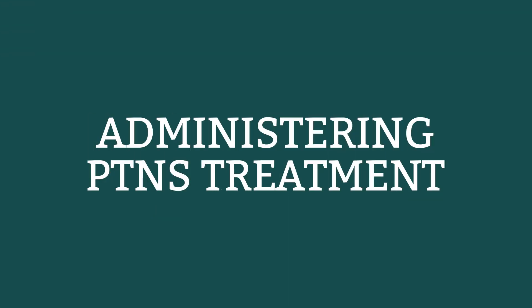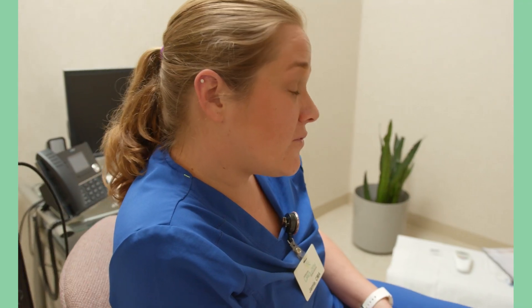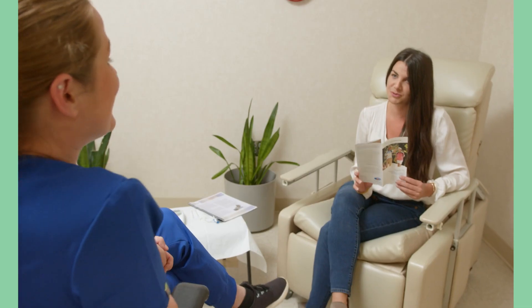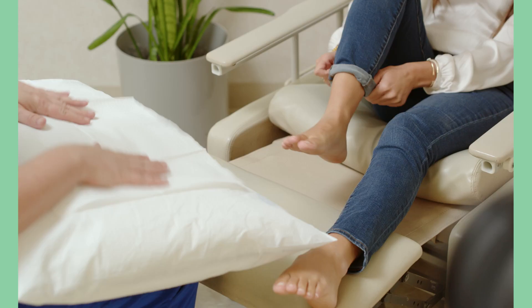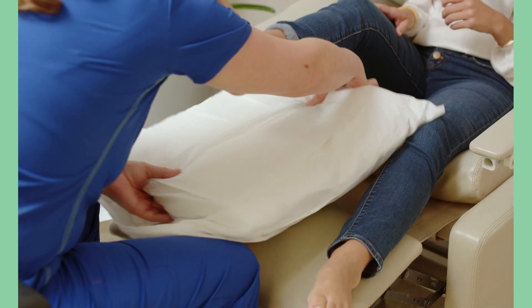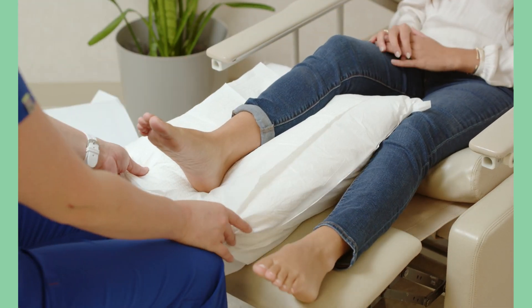Now that we have an understanding of the device operation, let's talk about administrating therapy to the patient. This is how I train our staff on PTNS so we can all deliver consistent care. Before therapy, it's important that patients are educated on the procedure and expected improvements. The first step is to get the patient comfortably seated and at ease. Because the treatment leg needs to be supported, we use this chair and footstool.